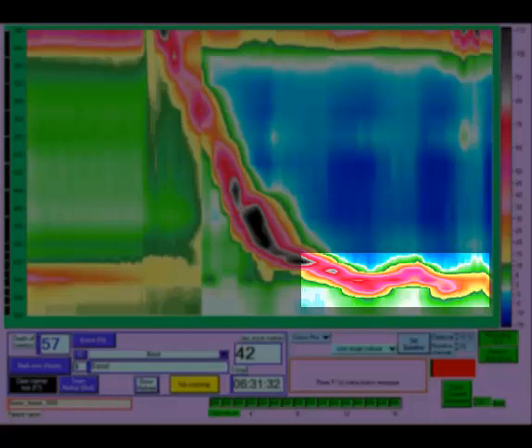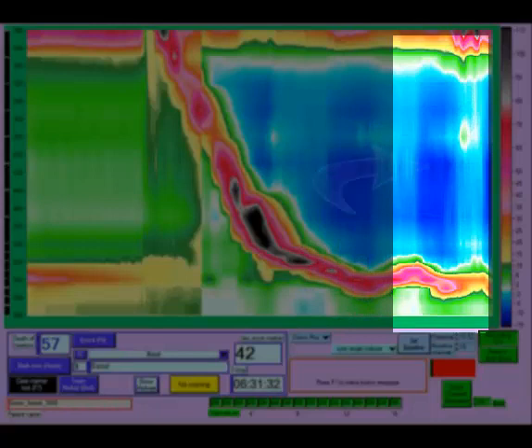To locate the diaphragm, ask the patient to breathe deeply, which will make the intrathoracic pressure more negative, that is a deeper blue, and the intra-abdominal pressure more positive, that is a deeper green. You will also see the pressure increase at the level of the diaphragm, and the diaphragm will descend.